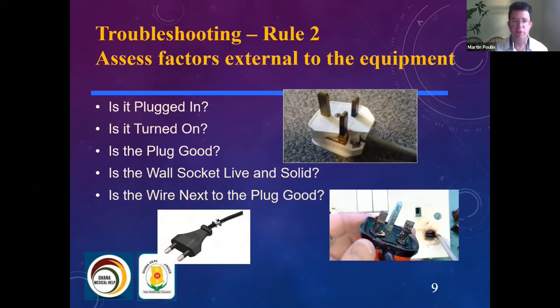This covers not only the power cord, but also the signal and power cords in the system of interest. Check and firmly seat all plugs. Is it actually turned on? Medical equipment sometimes has more than one power switch. Is the plug good and installed completely? Lack of proper installation of plugs has been disproportionately responsible for power losses and intermittent operation in portable equipment.